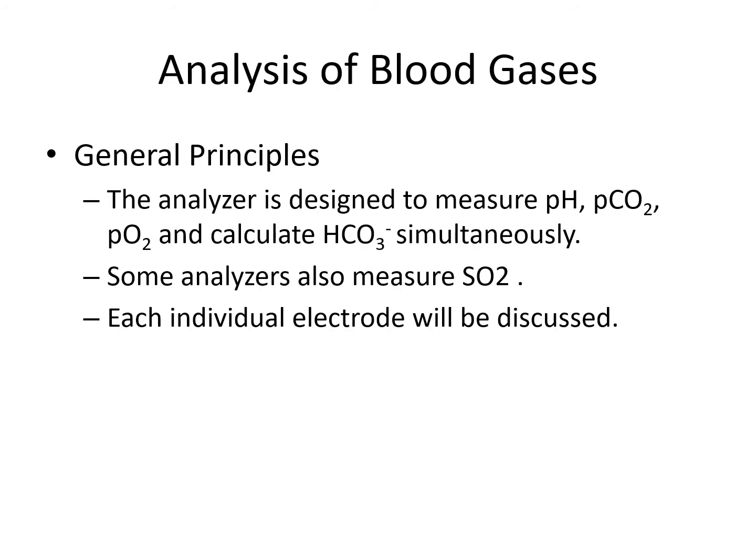There are many different arterial blood gas analyzers in the laboratory, and they are capable of measuring pH, PCO2, PO2, and bicarbonate simultaneously. Some can even measure the SO2 level, right? And the specimen that we use for the determination of arterial blood gas parameters is arterial blood. So they should be collected as we mentioned earlier, and the blood collection receptacle that we can use can be a syringe, the plastic syringe, the glass syringe, which is ideal, or the vacutainer system.